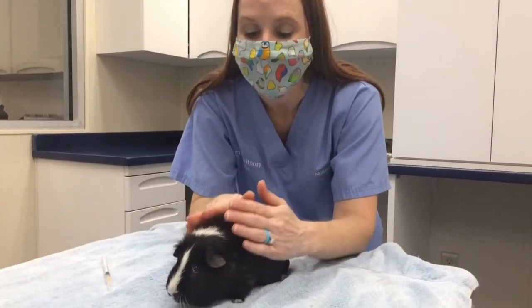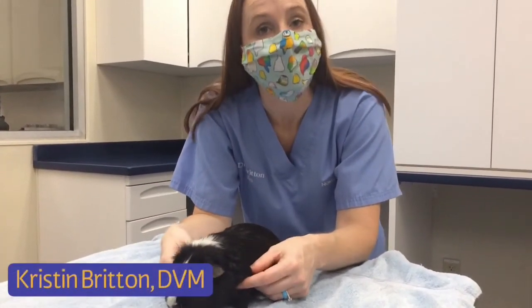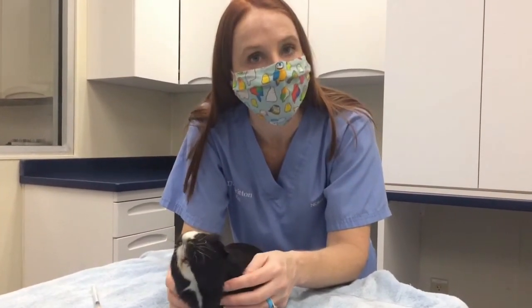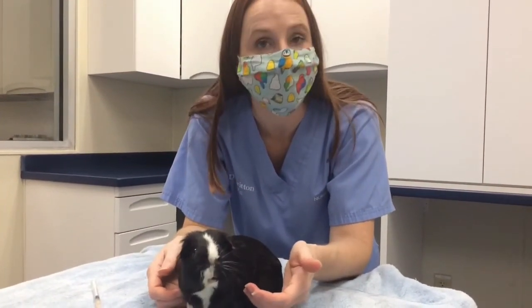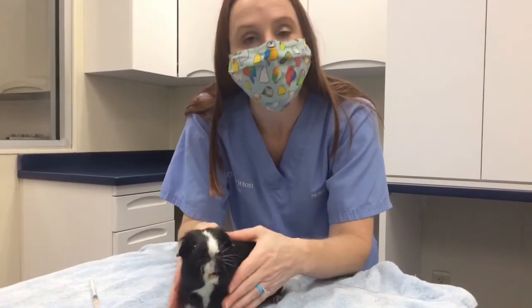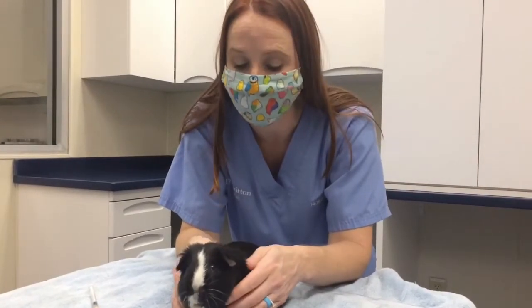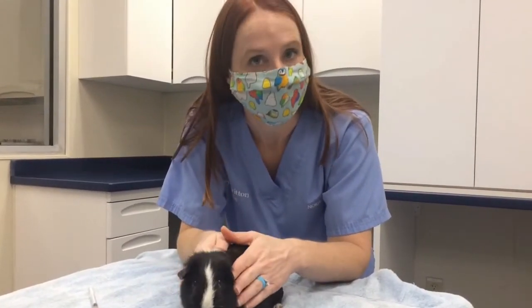This little guinea pig right here is in need of a sub-Q injection. Sometimes we send home antibiotics that need to be given underneath the skin. When we're doing that, we want to make sure number one that you guys feel comfortable, but also that it's safe for these little guys.